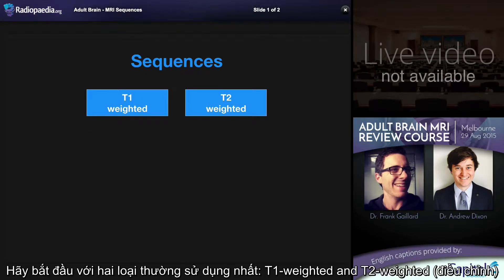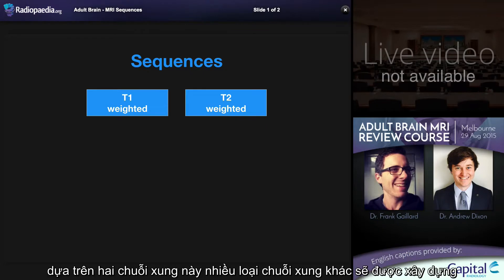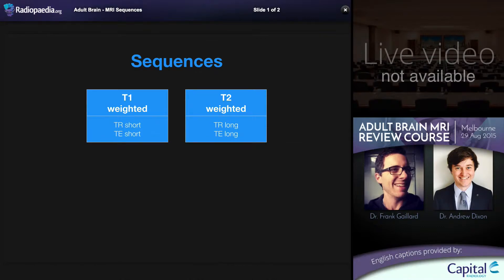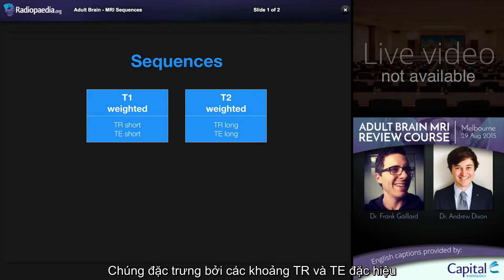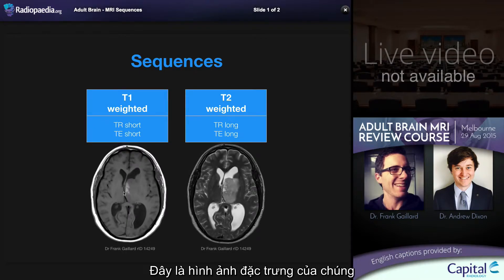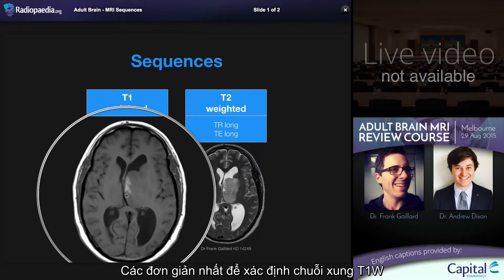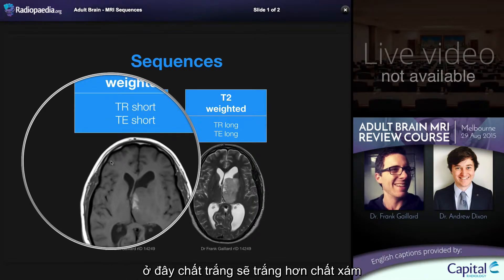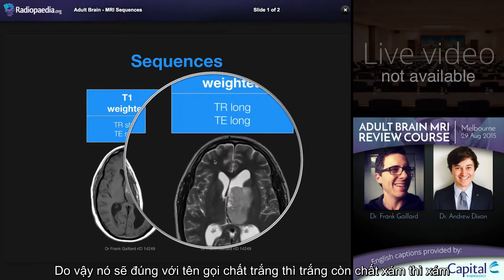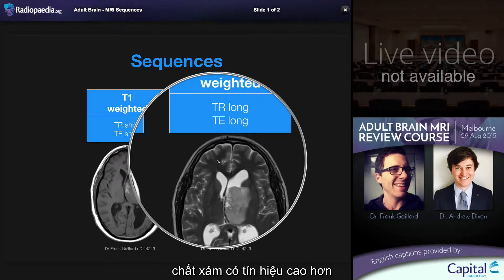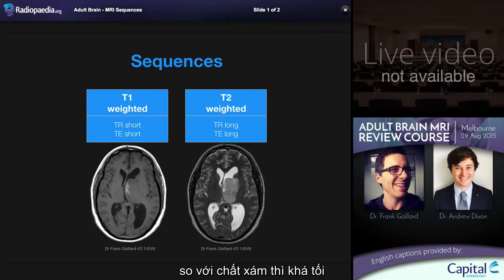Let's start with the main two that we are used to thinking about: T1 weighted and T2 weighted. These are the two fundamental anatomical sequences upon which many other sequences are built, and different tissues have different appearances depending on which sequence is chosen. They are characterized by specific TR and TE intervals, with T1 being short and short and T2 being long and long. The easiest way to identify a T1 weighted sequence is to examine the relationship between white matter and grey matter, where the white matter is whiter than the grey matter. In contrast, T2 weighted sequences have the opposite relationship, with the grey matter being more hyperintense compared to the white matter, which is quite dark.